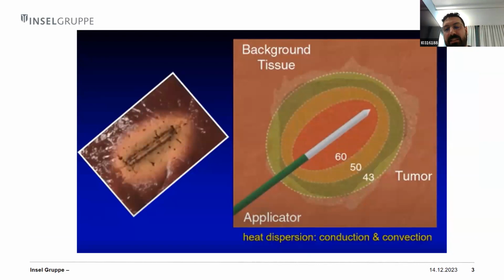Temperatures between 60 to 100 degrees Celsius are generated by high-frequency alternating current, and the ions in the tissue attempt to follow the changing direction of the alternating current. Post RFA ablation, the lesion is noted to have three zones: a central one of coagulative necrosis, a peripheral or transitional zone of sublethal hyperthermia, and surrounding unaffected tissue.